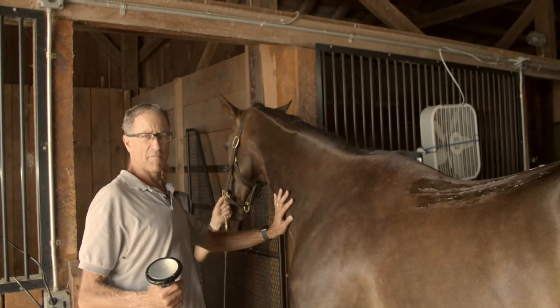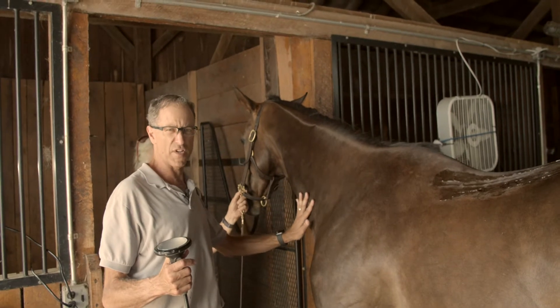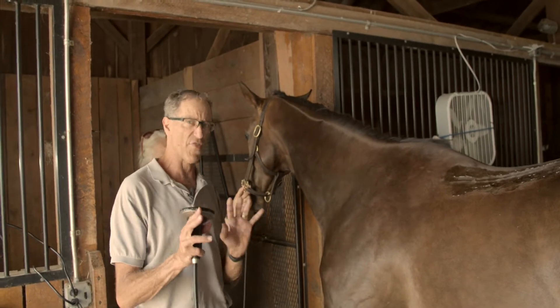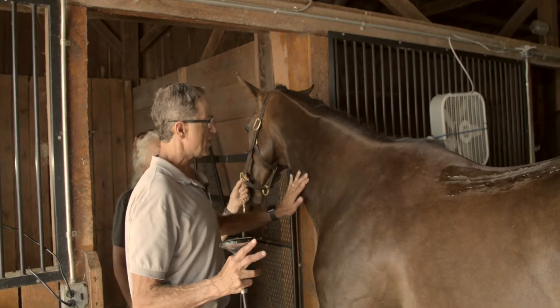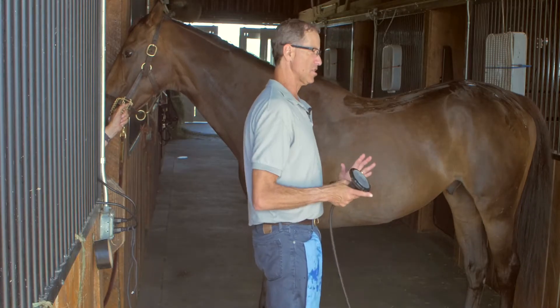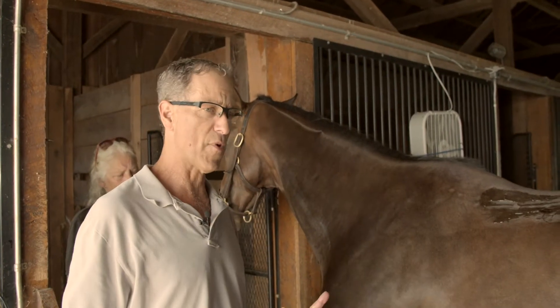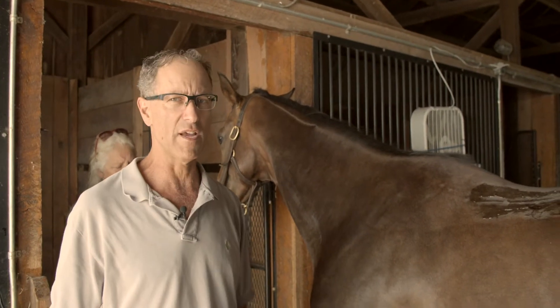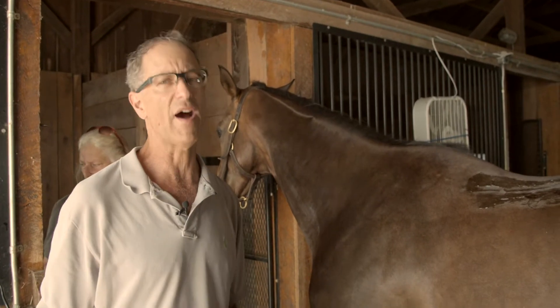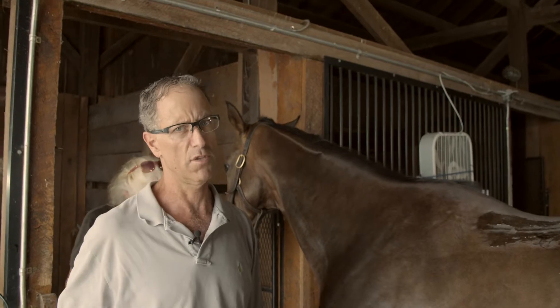You can treat the neck as well. Obviously you're going to use a much more superficial offset, somewhere around 30 millimeters, depending on where in the horse's neck you're going to treat. You can adjust the system to treat anything in the horse's body — you just have to know where the problem is, what the anatomy of the area is, and then figure out what offset pad best directs and focuses the treatment.